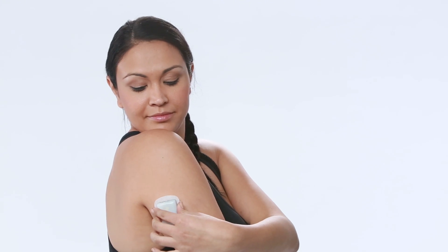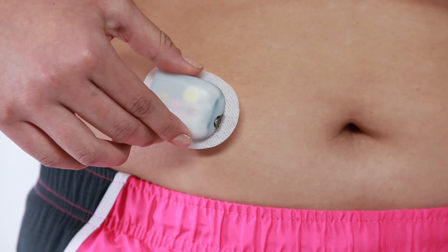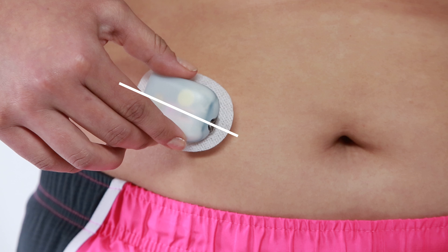The pod window may face up or down. If you're placing your pod on your abdomen, back, or buttocks, position the pod horizontally or at a slight angle for comfort.